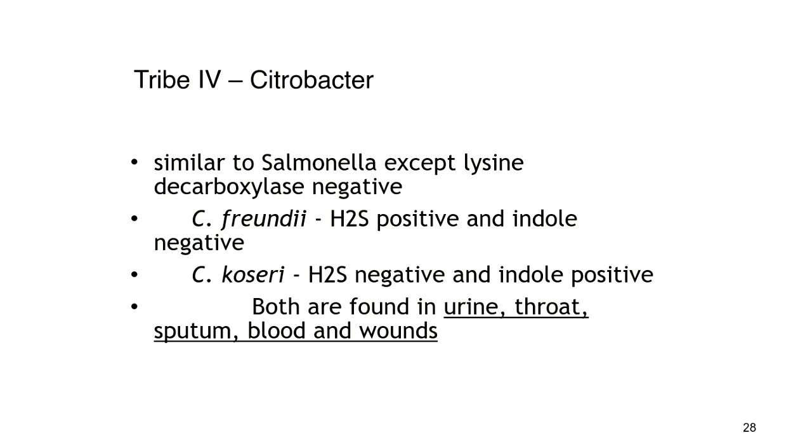Tribe 4, Citrobacter. Again, similar to your Salmonella, but there would be a test called lysine decarboxylase negative.